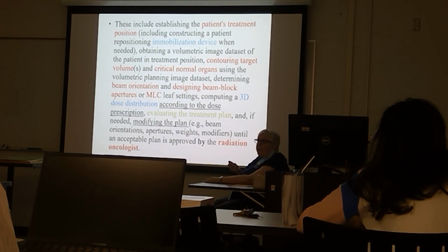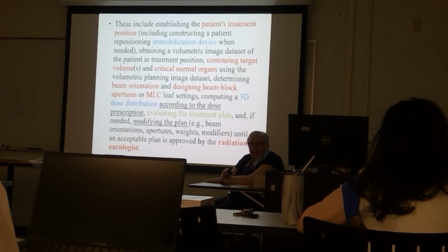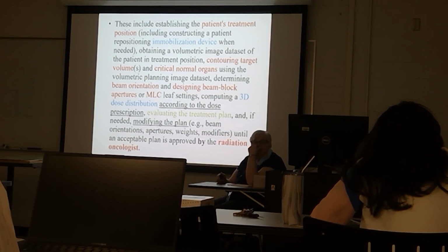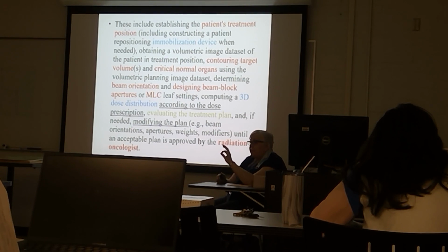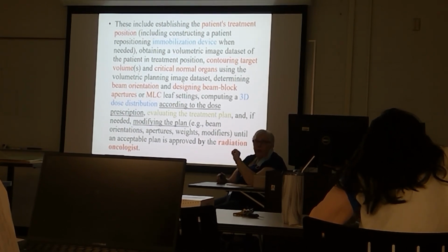You can discuss it with them and say, wouldn't it be better if? And if they say, no, I want it done this way, okay. The department I worked in California, one physician demanded that we match the cone beam CT to the bony anatomy, and the other one, soft tissue. So you have to remember whose patient's who.